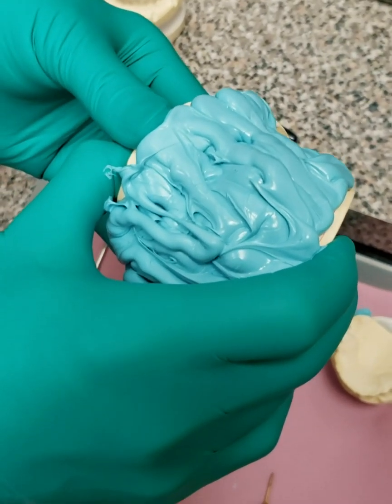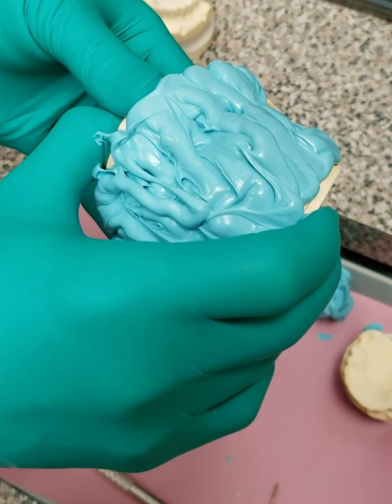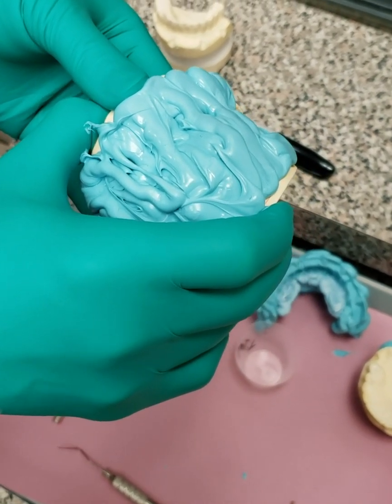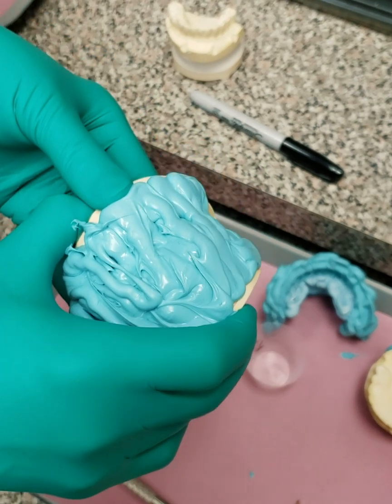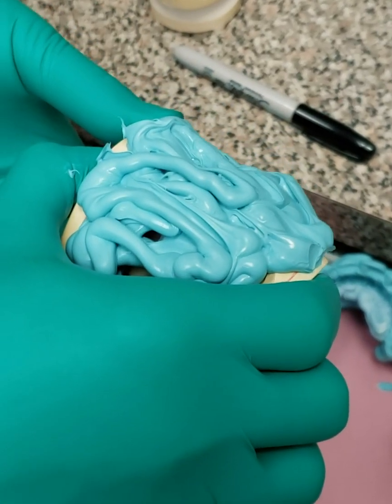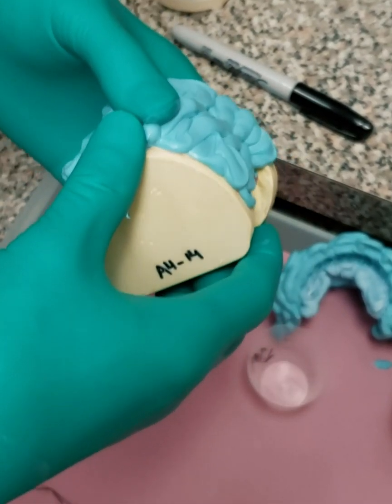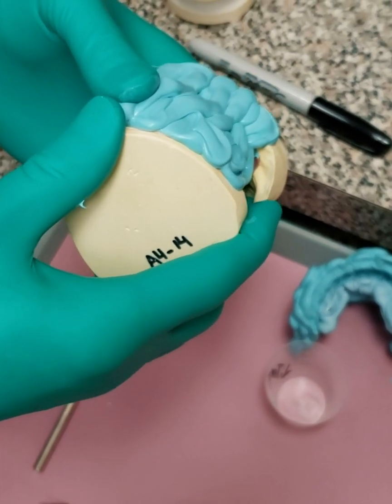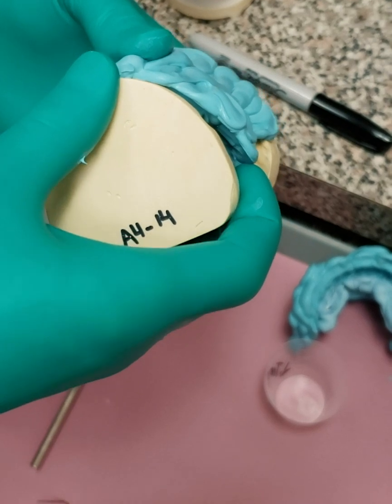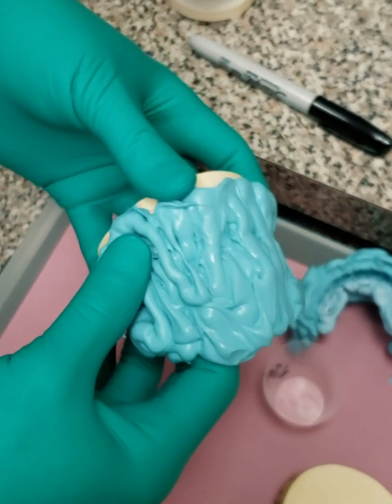What you want to do is completely cover the grooves that are made onto the model. So now you have an upper working model and a lower working model, and this will relate the upper to the lower. Wait till it's set. Again, this goes all the way around. Once it's set, peel off. Again, you're not going to break anything. Peel off toward the buccal. Peel off toward the buccal.